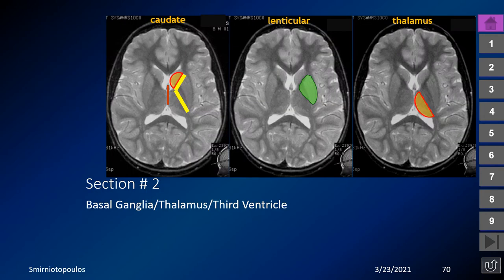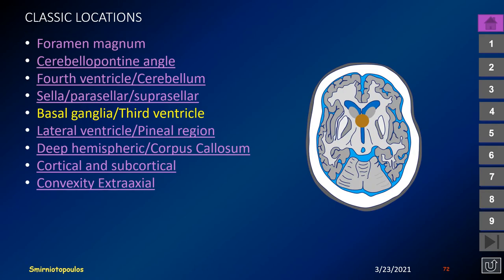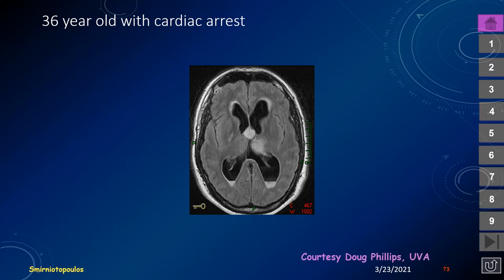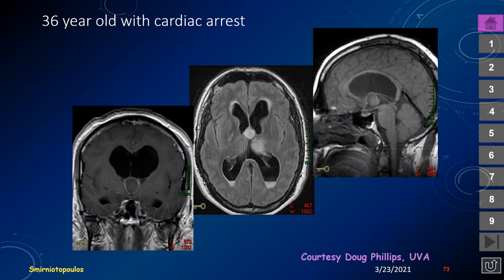In this next section we discuss lesions involving the deeper parts of the brain — the basal ganglia, thalamus, lenticular nucleus, and third ventricle. This 36-year-old presented with cardiac arrest. Imaging shows a rounded mass in the anterior third ventricle with a blood-fluid level in the dependent portion of the occipital horns. Coronal and sagittal images demonstrate a rounded mass in the anterior third ventricle with peripheral rim enhancement — a classic presentation for a colloid cyst.